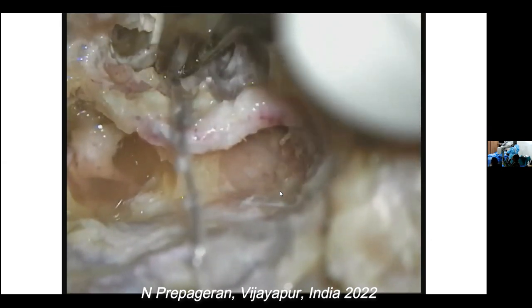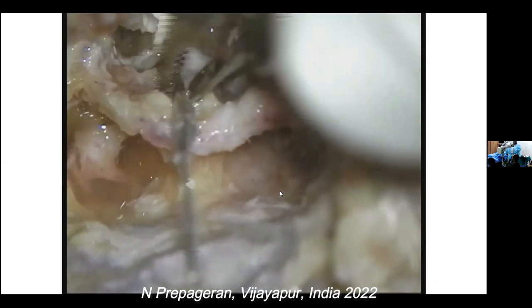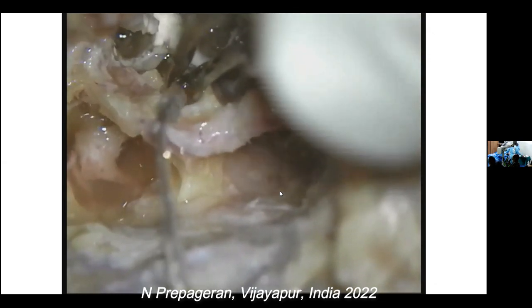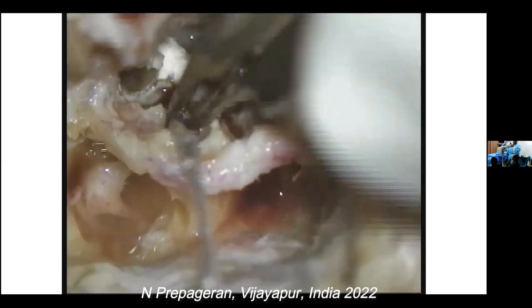This electrode is too short, guys. I don't think this was meant to go through. It's okay. There. Can you guys see the fluid movement? Yes. Yeah, because the electrode is too short to come out the other side.